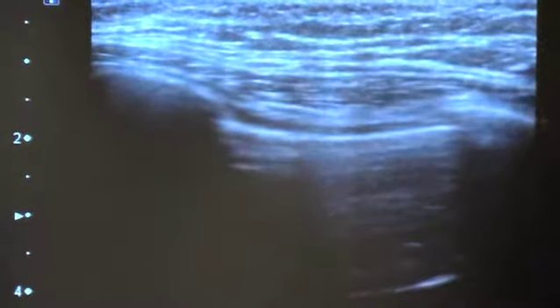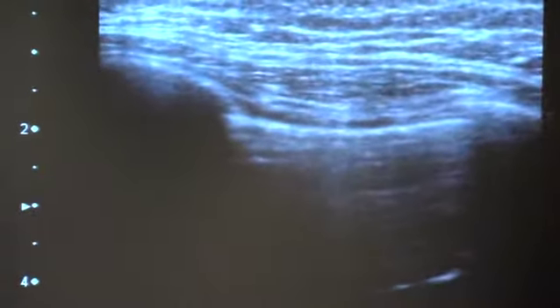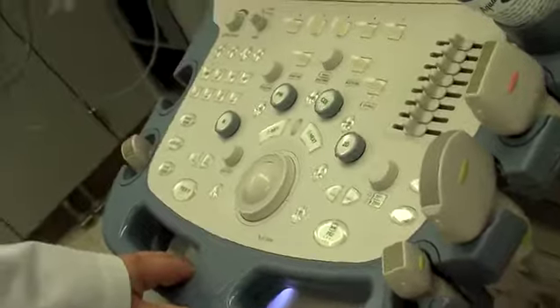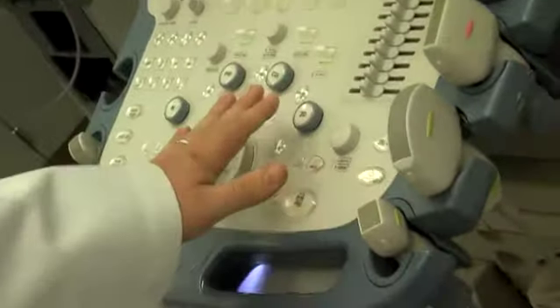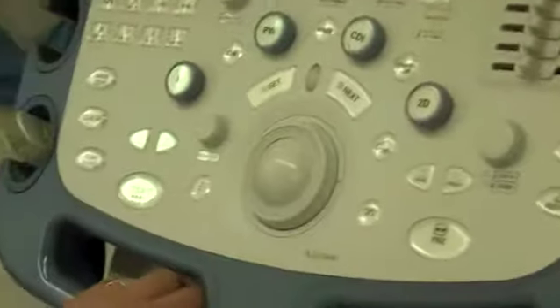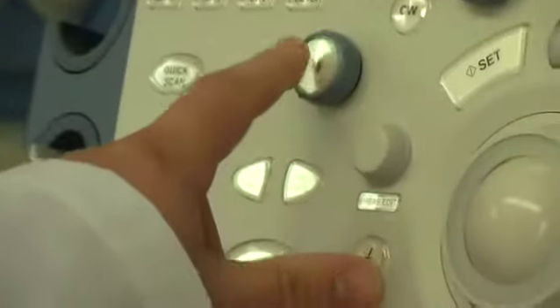Now, I'm going to show you guys another way you can rule out pneumothorax. Instead of using the 2D mode, we can change the mode on the ultrasound machine to use M mode. M mode stands for motion mode, and here's the button right here. Motion mode detects moving structures or moving reflectors at a certain distance on a certain scan line.